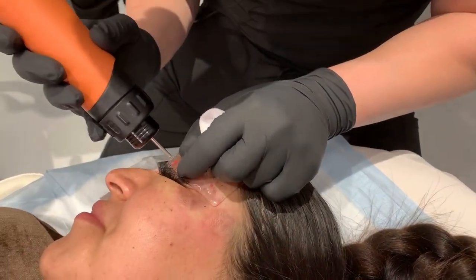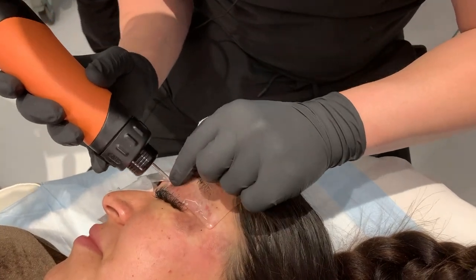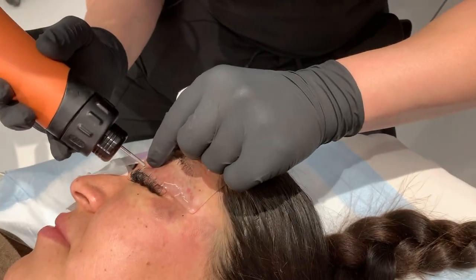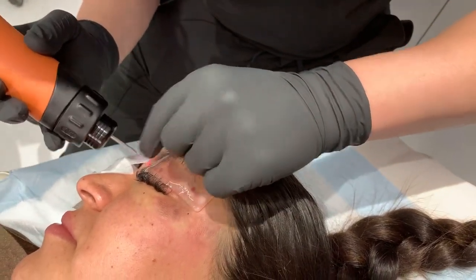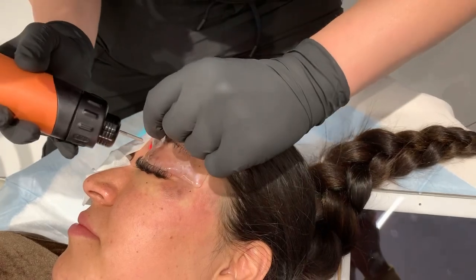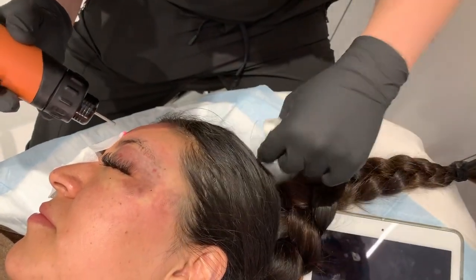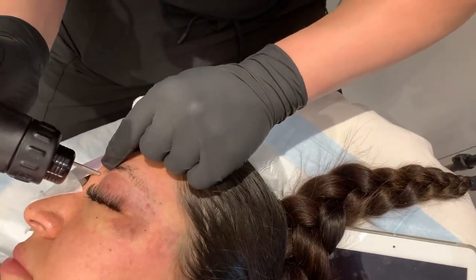How many days or months does it take for the skin to become normal? As we can see, it's turned a little dark. One to two weeks it takes for the darkening effect. And then about 6 weeks for us to really see how much pigment's been reduced. And then we do another treatment.